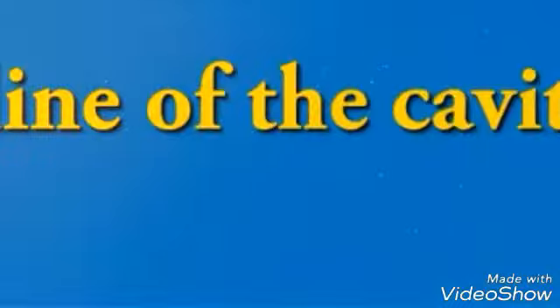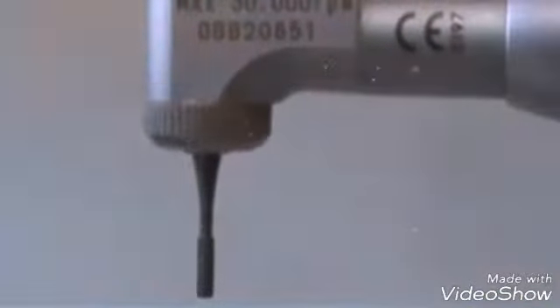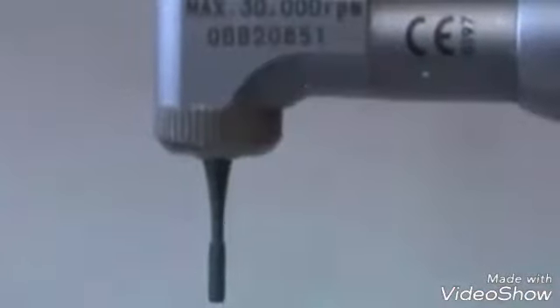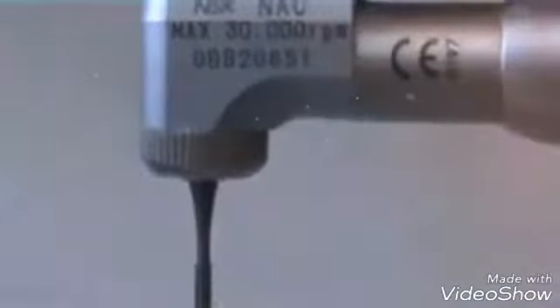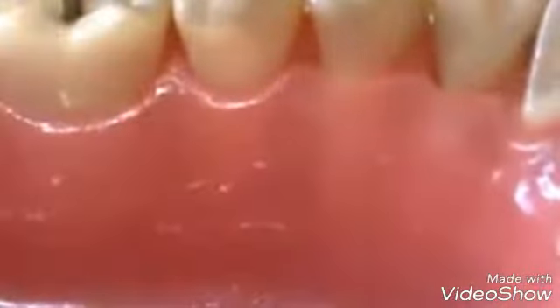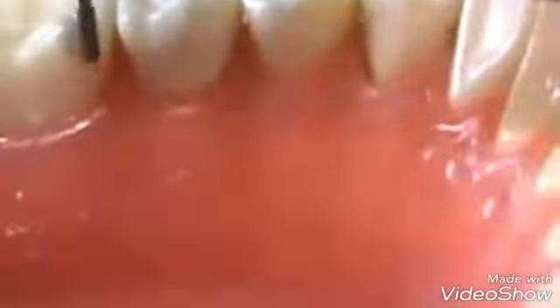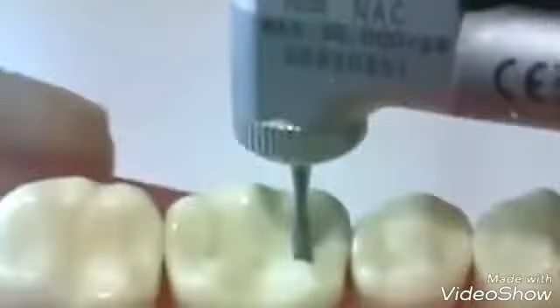Step 2. Outline of the cavity. By the use of a fissure bur, we make the outline of the cavity. The bur is held also perpendicular to the occlusal plane inside one of the holes, and then we move it along the fissure to the other hole.